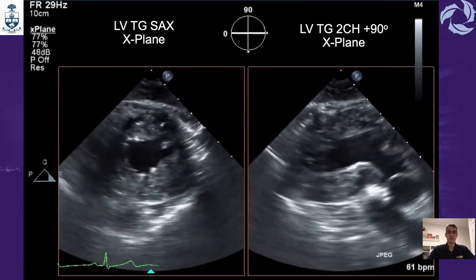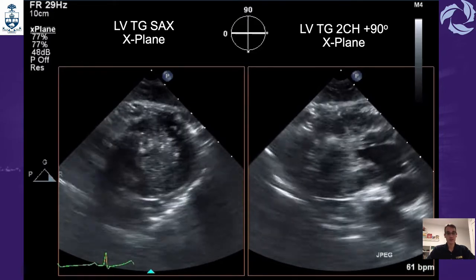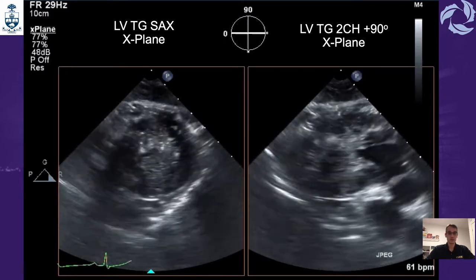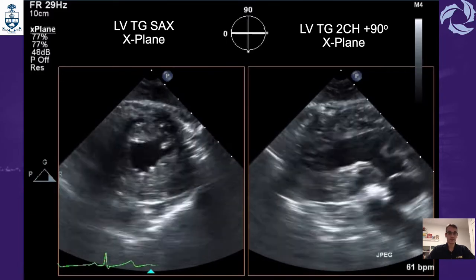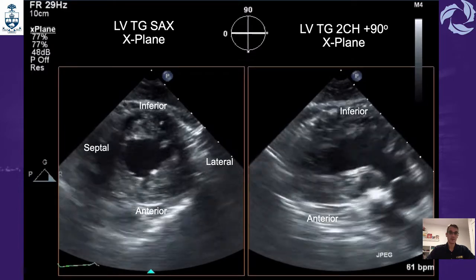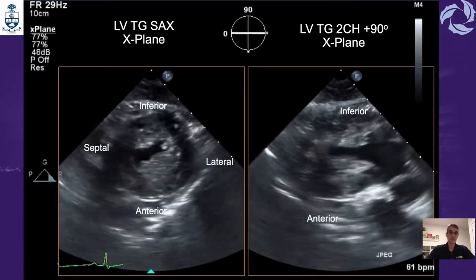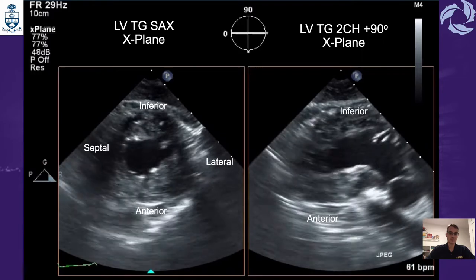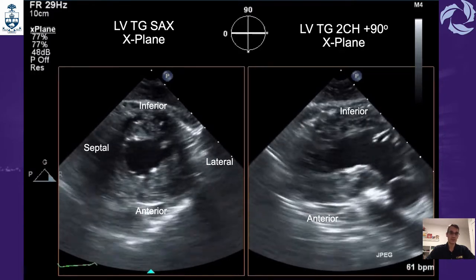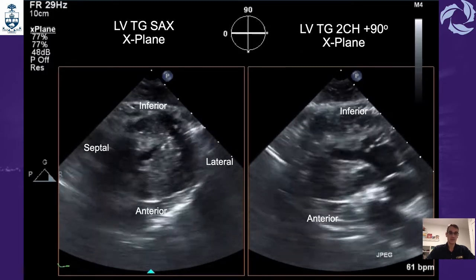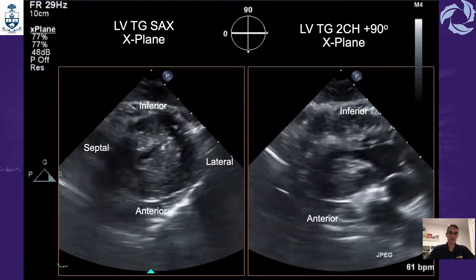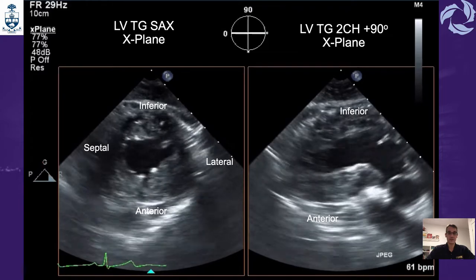Using X-Plane again from the transgastric short axis view of the left ventricle, as shown on the left side of the screen, we can do the same thing. We place the X-Plane into the middle of the LV and we are able to simultaneously assess six walls of the left ventricle. In the transgastric short axis on the left side of the screen we have the anterior, inferior, septal, and lateral walls. On the right side of the screen the generated plane at 90 degrees shows the anterior and inferior walls.